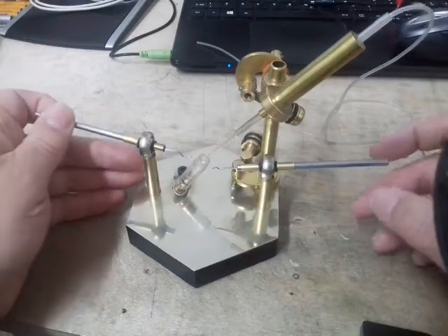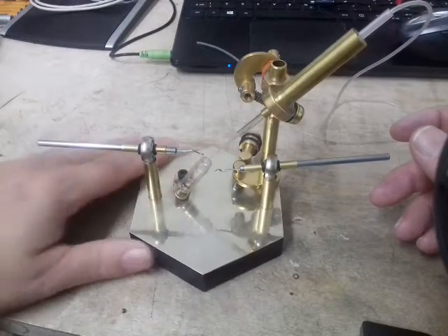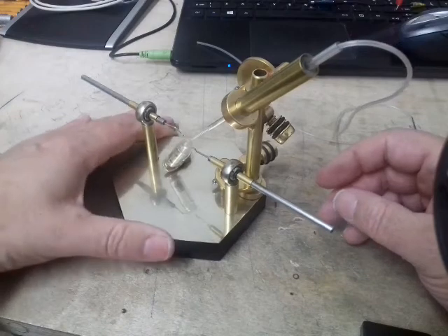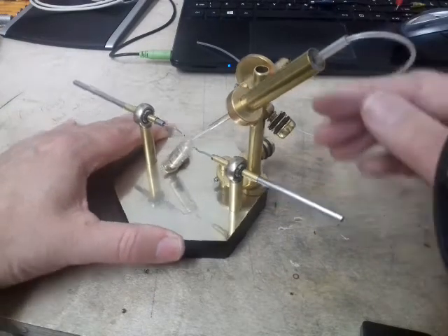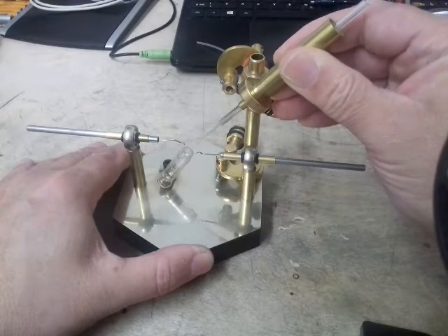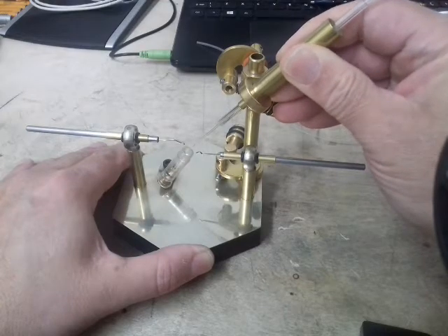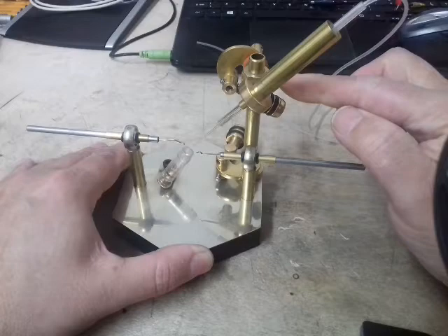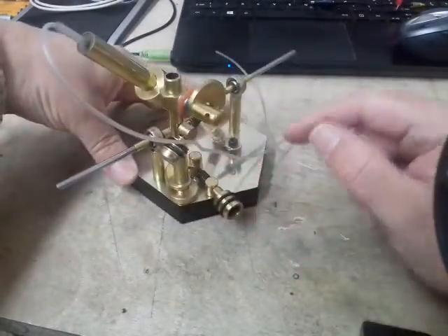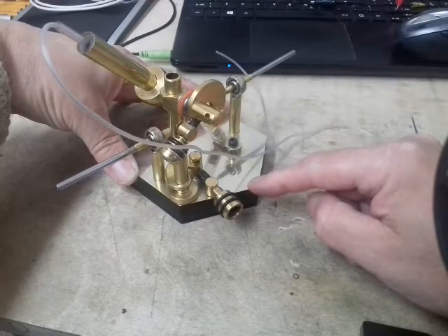This unit I made to try and use with tweezers, but I found tweezers just too fiddly. This one, I think, is about the third one I made. The feed is done manually, a nice tight fitting, sliding tube within tube there. But this one moves left to right and backwards and forwards with the aid of these inch levers. And believe it or not, this little unit has turned out to be the best one of all.